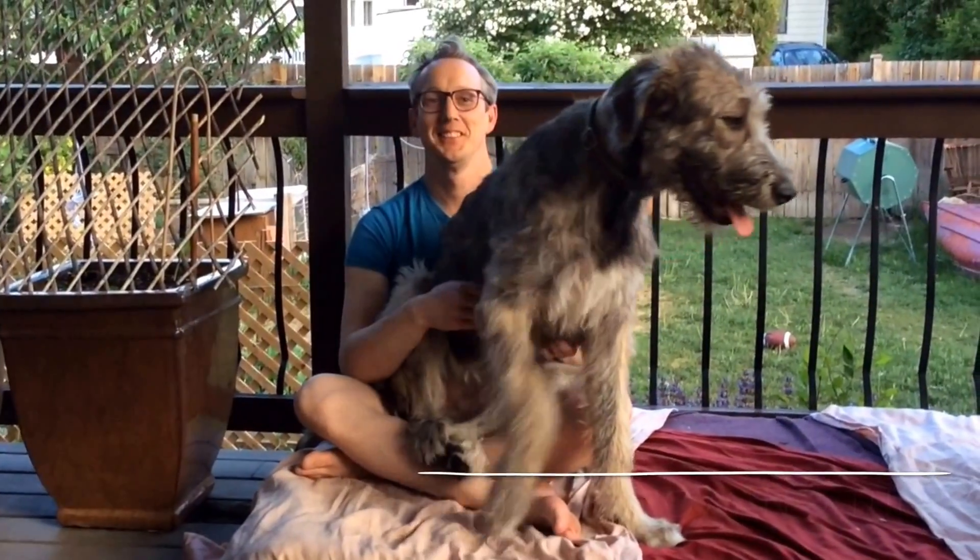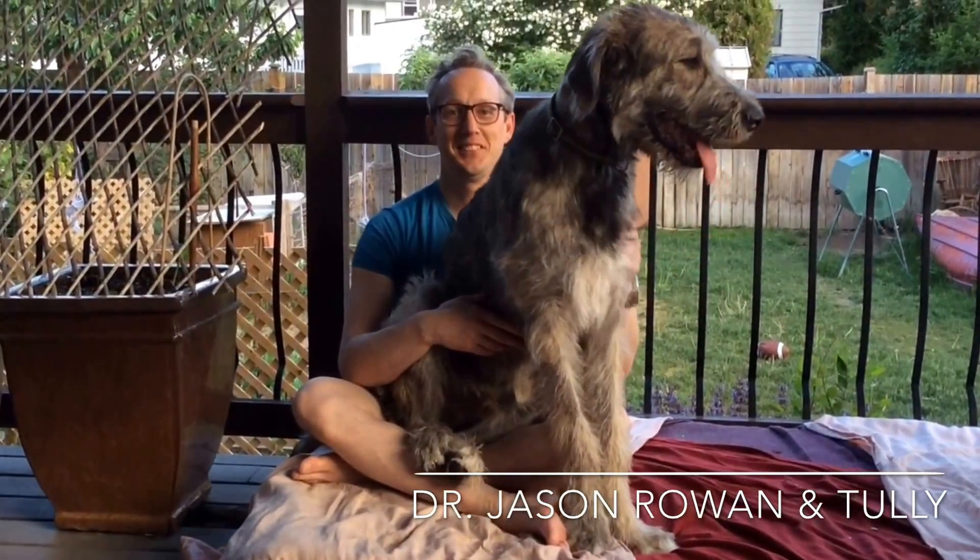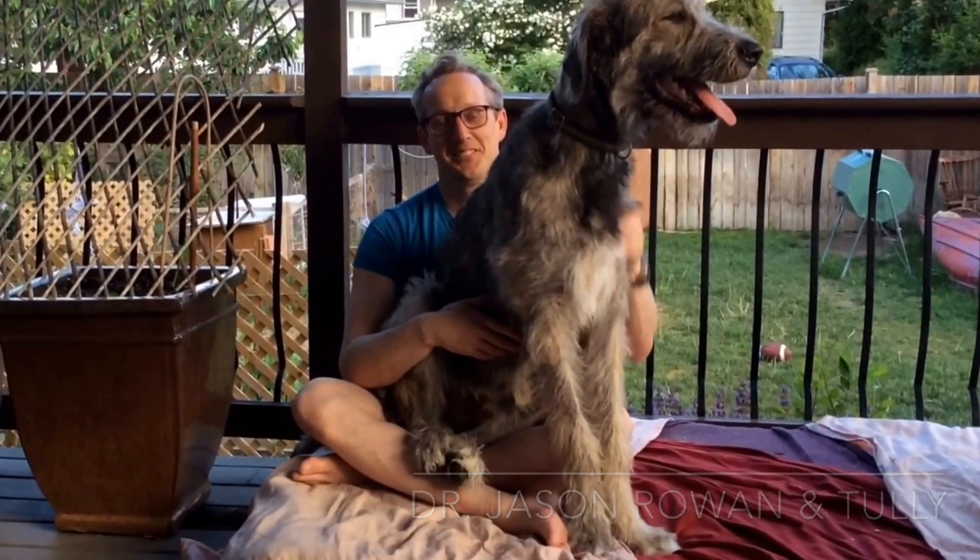Hi, my name is Dr. Jason Rowan and this is my six-month-old Irish Wolfhound puppy Tully. Today, Tully is going to be evaluated for hip dysplasia.